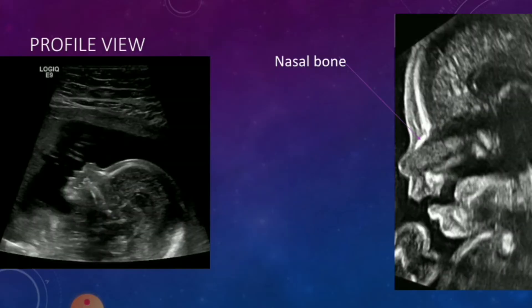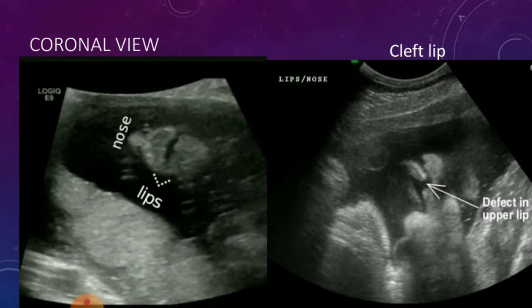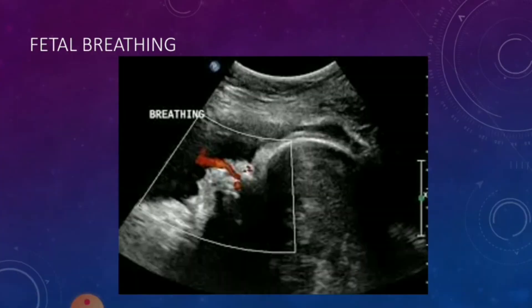Next, you want to look at the face in a profile view. A profile view is good to rule out facial anomalies — you can see the nasal bone, and also the sagittal cerebral structures like the corpus callosum. A coronal face view is important for ruling out facial anomalies like cleft lip. You could also rule out things like a proboscis. In a coronal view with color Doppler on, you may even be able to see fetal breathing, which is important.